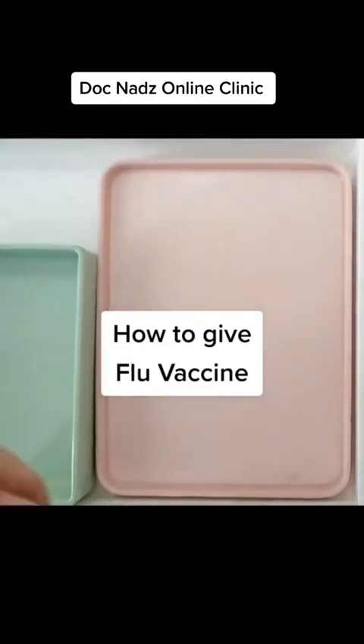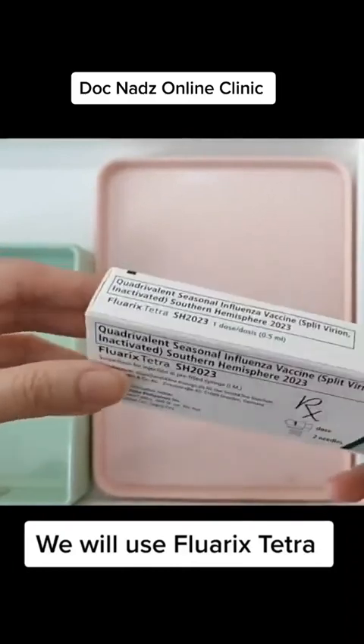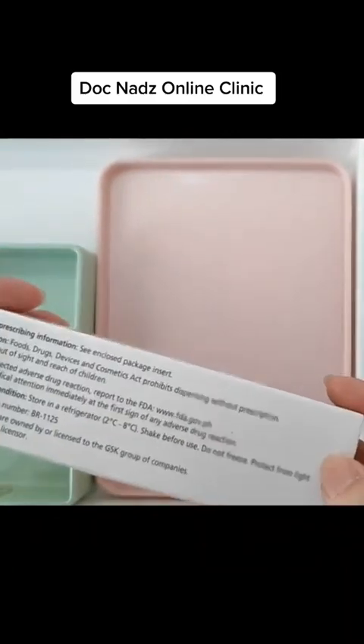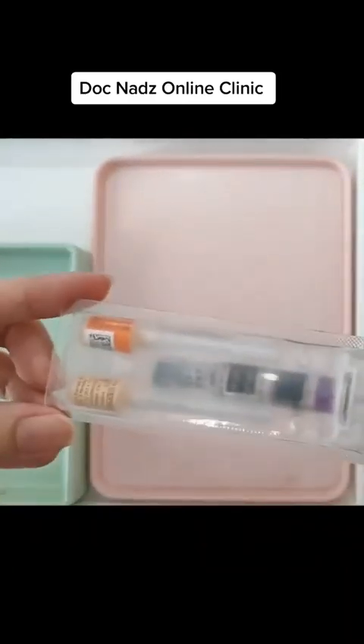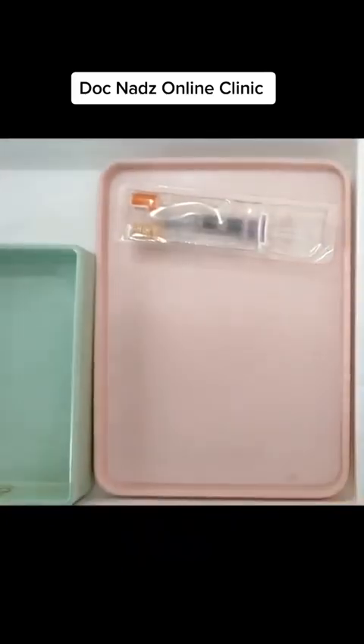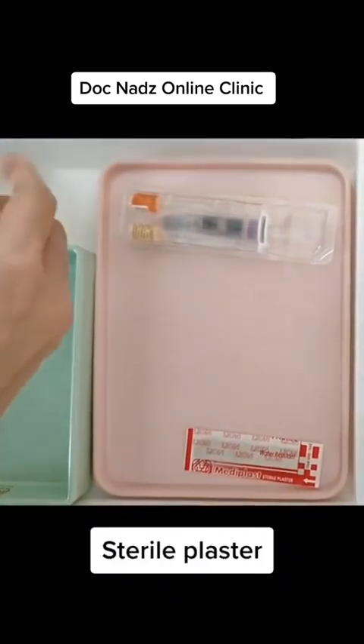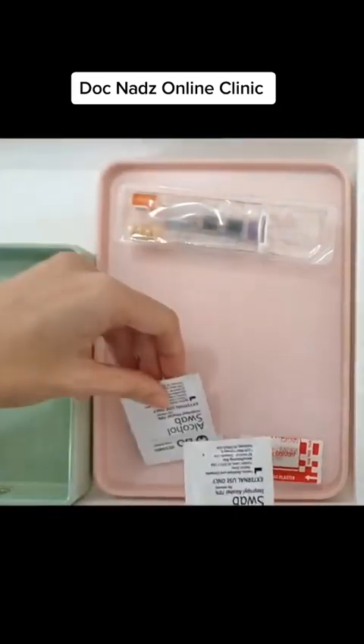How to give flu vaccine. Today we are going to use Flu Arex Theta. It contains a pre-filled syringe and two needles. We need to prepare sterile plaster and alcohol swabs.